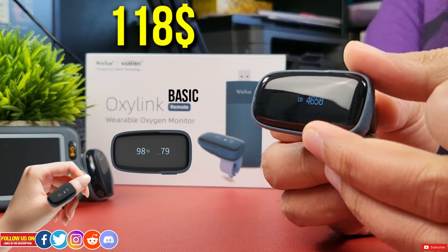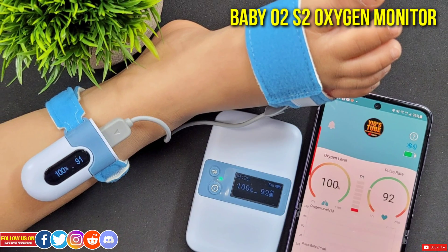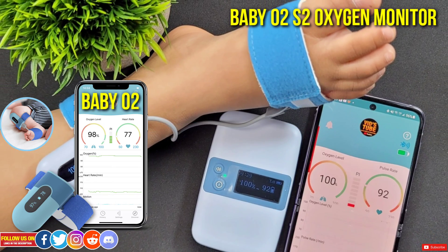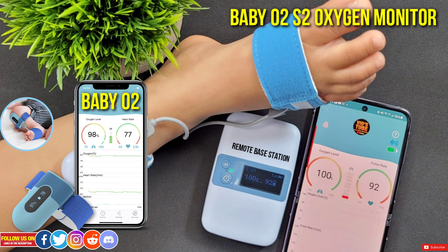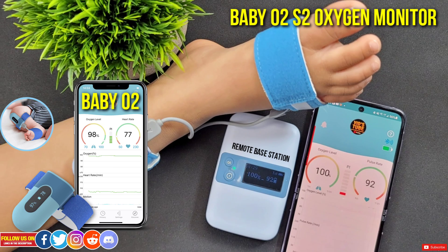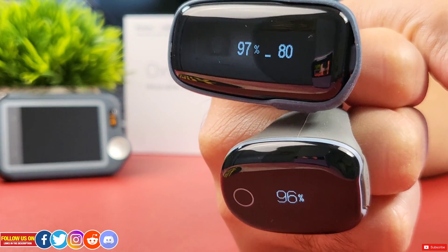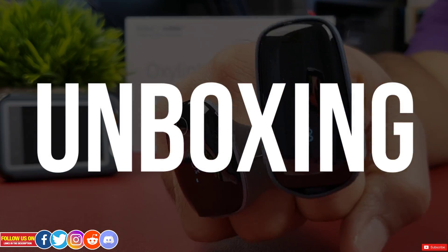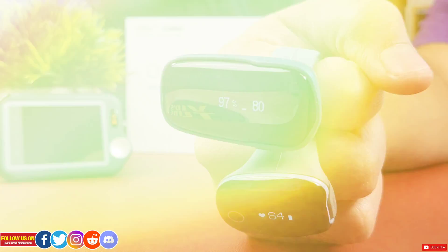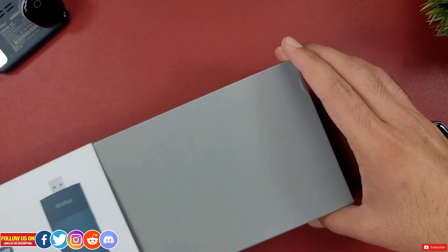The OxaLink Basic does not include the remote linker — it's similar to the Baby O2S2, which is more expensive than the Baby O2 alone because it has a remote base station. I have done a review video for the Baby O2S2 oxygen remote monitor, linked at the end. Stick around as I'll explain everything to help you decide which one to get.